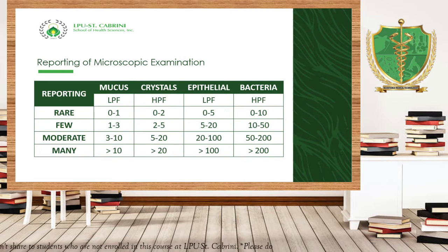Okay? You guys should be aware of what you are reporting before you release the results. Make sure that you validate the results before you affix your signature, before you write your license number. Make sure that you validate, that you review, that you analyze again the results.